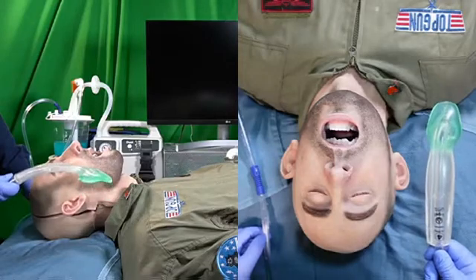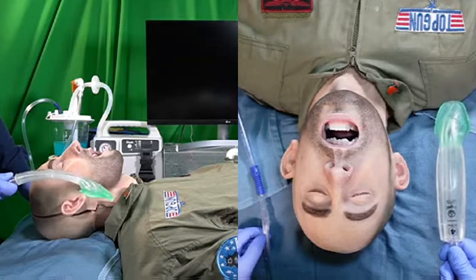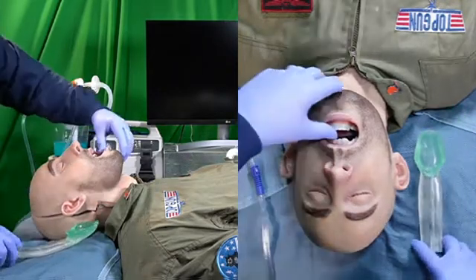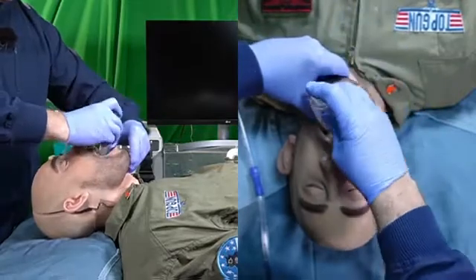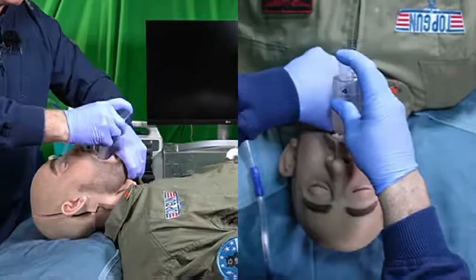I would like to go over some insertion techniques that will simplify the successful placement of the airway on the first attempt. The standard technique is the mandibular lift, where the airway is placed into the pharynx and around the posterior pharyngeal wall and into the hypopharynx.